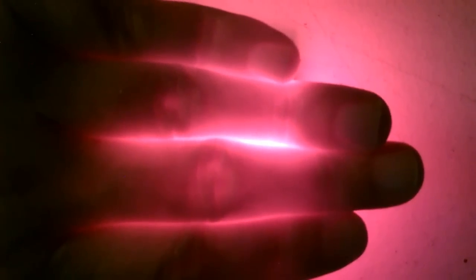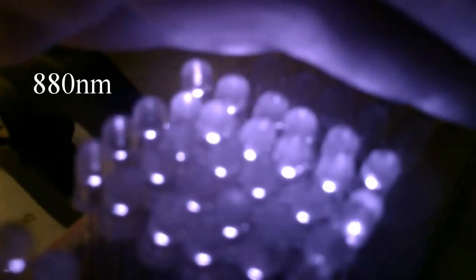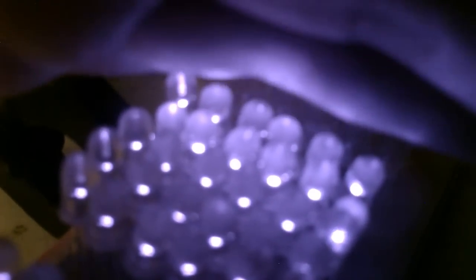Here's a shot of the small board with my hand covering it. Check out how it penetrates — it goes right through the fingers. Here's a quick shot of the 880 board. They're all lit up. It's just kind of hard to tell because if they're facing in a slightly different direction, it'll look like they're not.